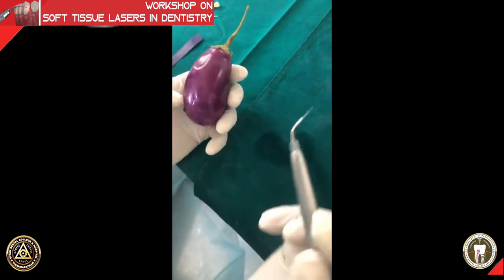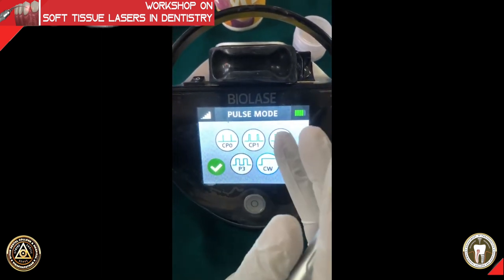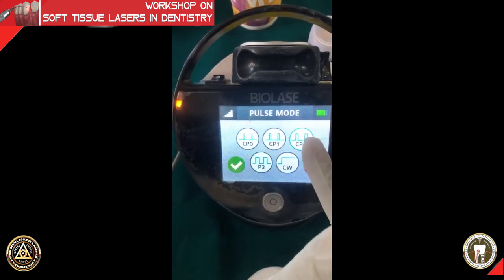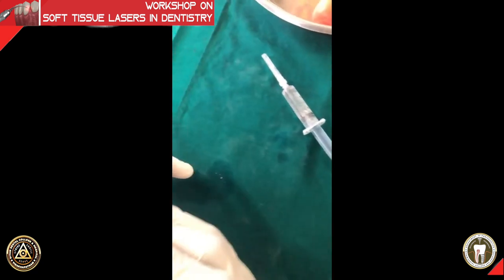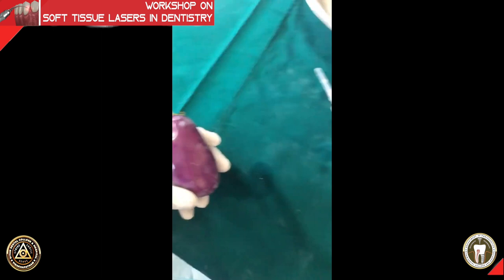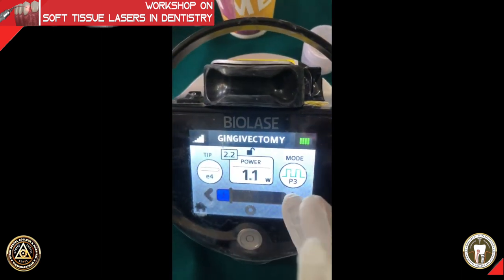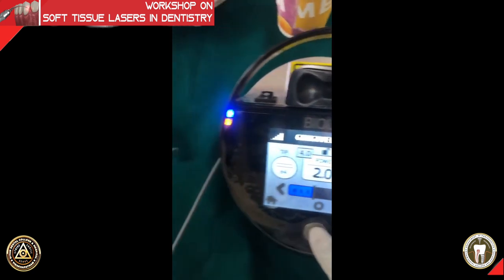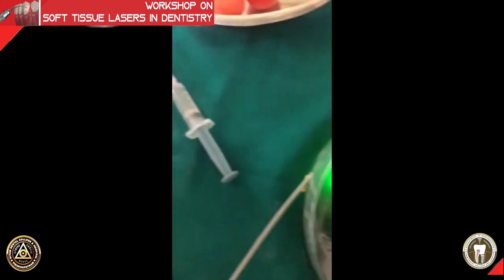Now we are going to do an incision right adjacent to the continuous wave incision, in pulsed mode at 50% duty cycle — that is 50 and P3. We need to use higher power because at one watt it will not be effective. So we are now going to proceed with the 50% duty cycle pulsed mode.